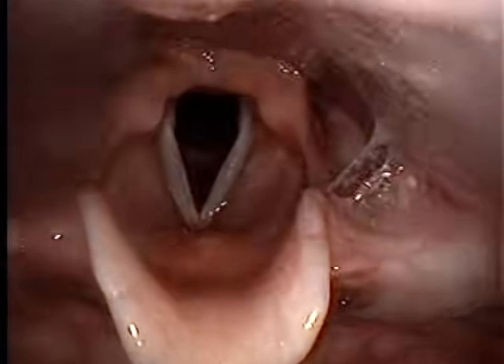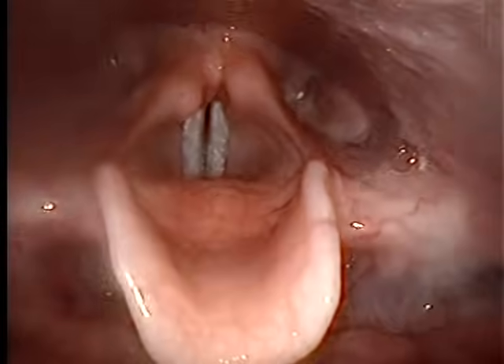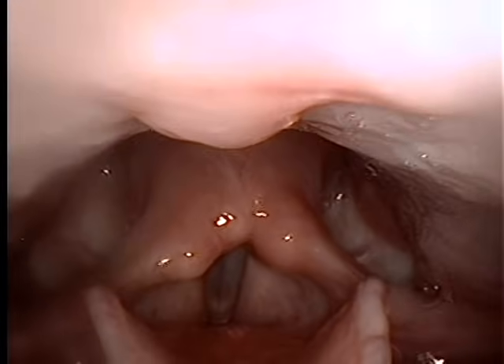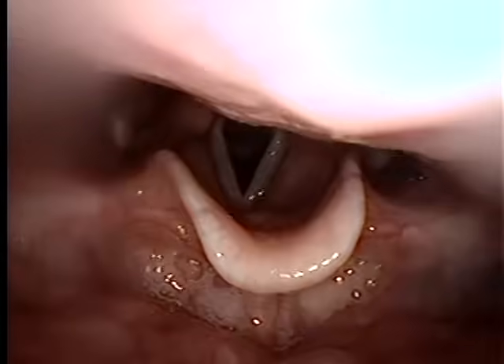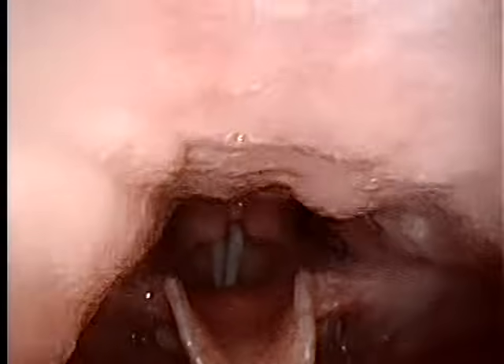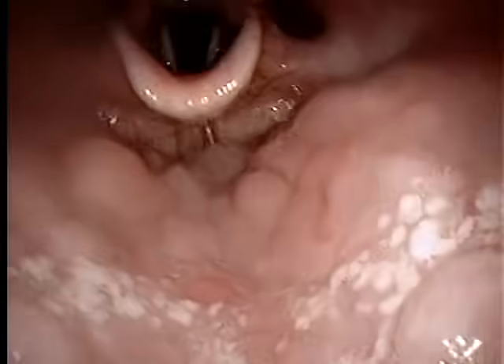I'm going to do this on G4. I'm going to do classic eval, mix eval, and then you will have to do it with your belt. Pull it back just a little bit. Ee, ee, ee, ee, ee, ee.